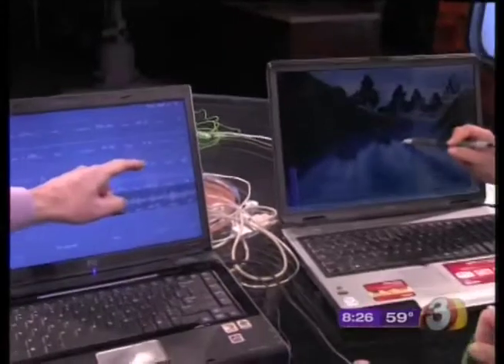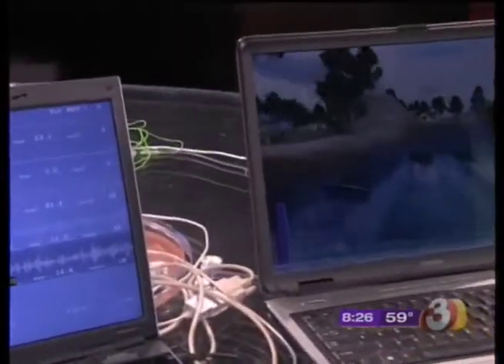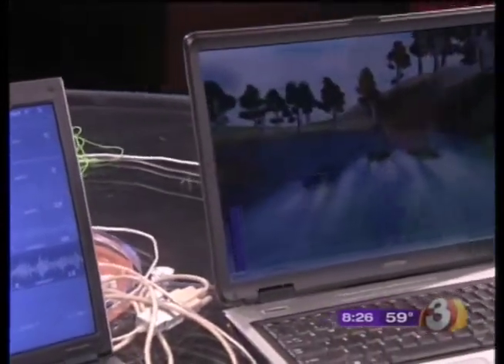And you say, oh, go ahead. I was just going to say, what are you reading from me, or not? Well, as you focus, let's see if we can make that middle one go. See if you can control that just by maintaining a nice, calm focus. Bob, are you able to get this shot now? As you do that, let's see this. Like I'm doing anything. Well, you are, because you see this wave is changing now. And actually the voltage of it, there you go. But it wasn't before, because you were somewhere else. And physically, he's not moving his body. This is just through his mind.